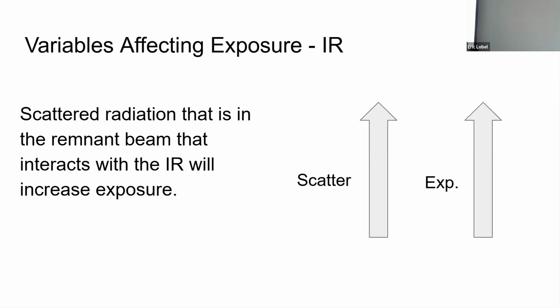The next thing that you'll probably see, besides better noise reduction techniques, will be flat panel detectors with different sizes. Right now, it's almost one size fits all. I have seen smaller 10x12s that are used pretty much exclusively for pediatric portables, like neonatal. But if you look at older CR and older film cassettes, there's a whole variety of sizes. Right now we've only gone down to basically one, and sometimes 10x12s. Fine. So as the price goes down, then we'll see more of them.